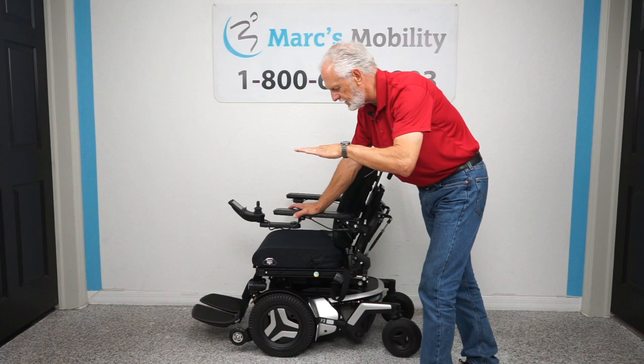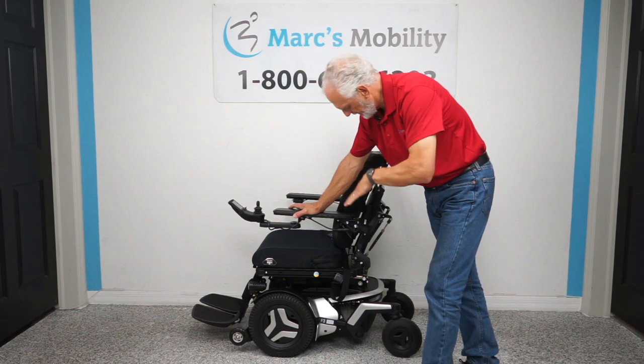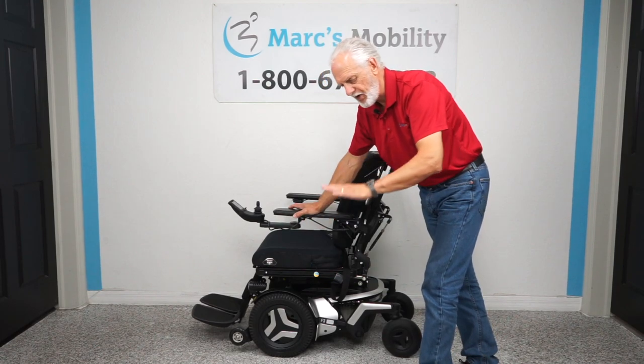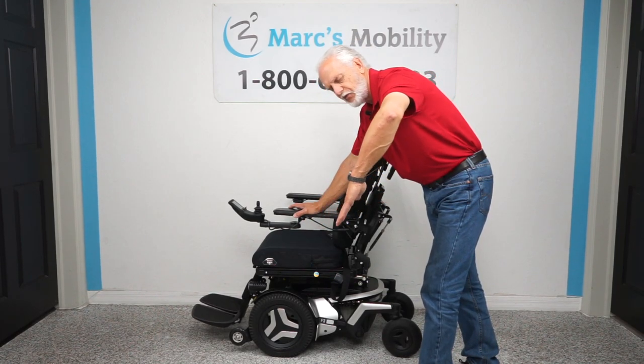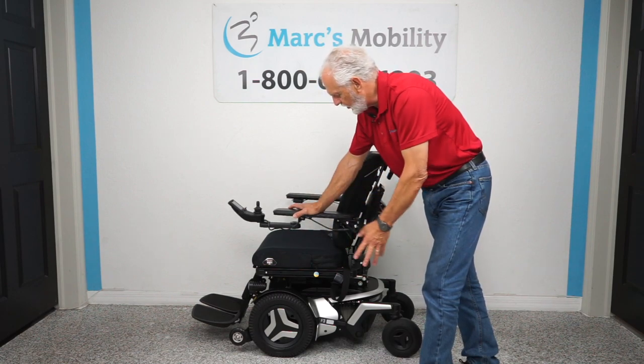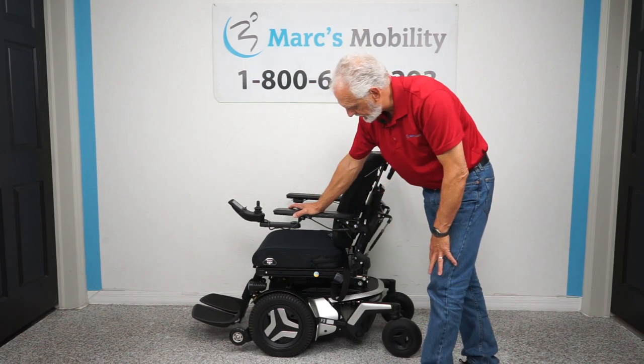It has a 12-inch seat lift, electric tilt, electric recline, electric leg, and it also has the interior tilt where the seat tilts forward — 5 electrical functions. It also has factory headlights and all kinds of goodies on this chair. Very nice power chair.